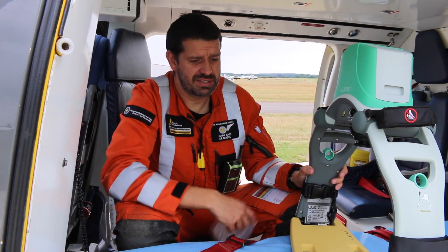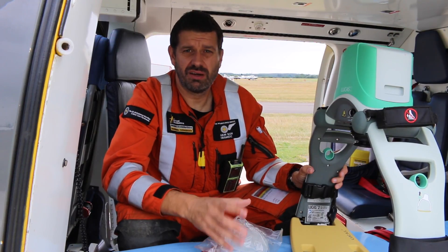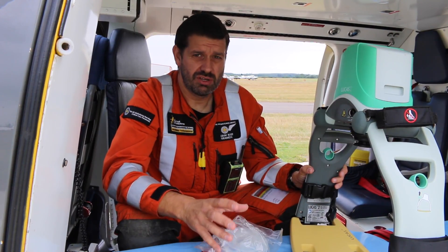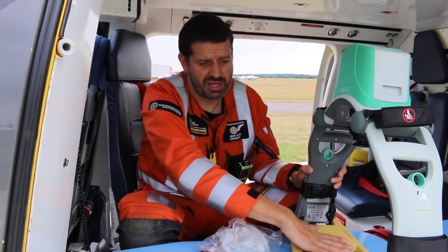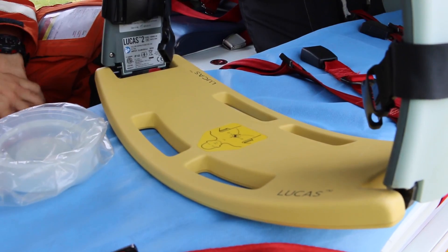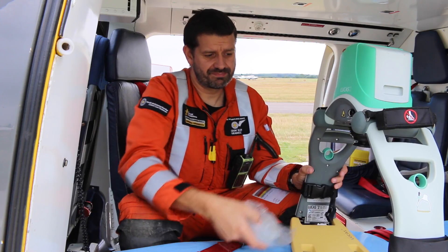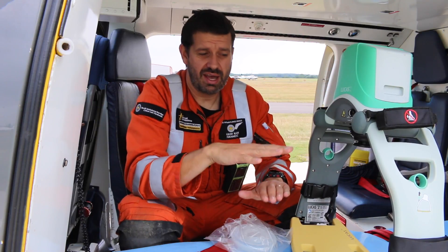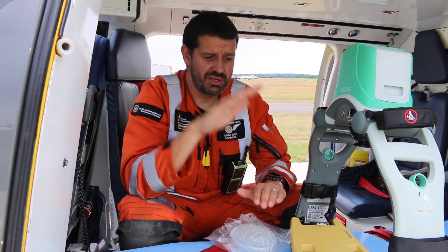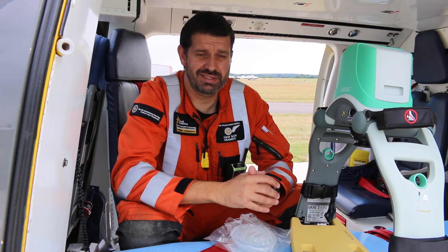The Lucas device is basically a piece of equipment that takes over the chest compressions role of the operator in CPR. So by placing the patient on this backboard and attaching the bridge over the top, we put one of these suction cups on. That goes on the patient's chest and the machine measures and gauges the pressure and depth required to perform effective chest compressions to aid our resuscitation attempts.